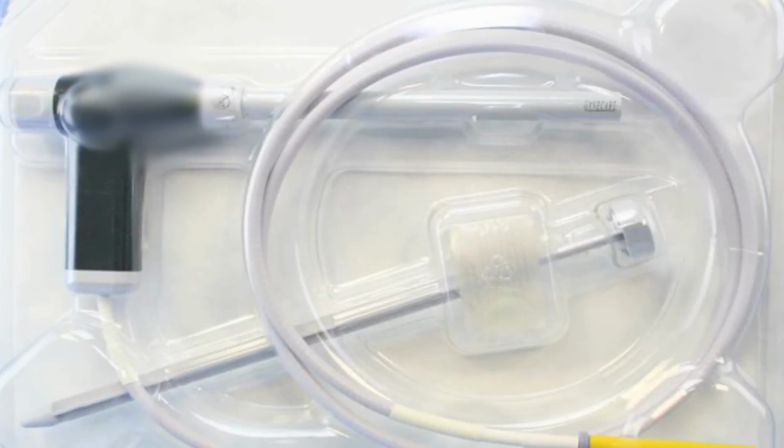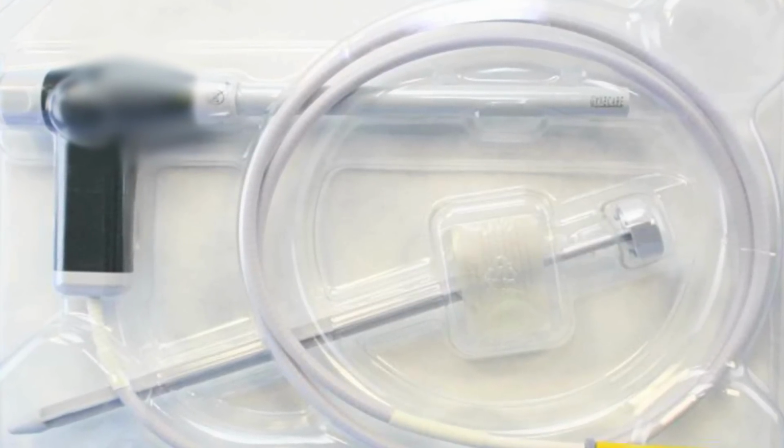The product that we're looking at is manufactured by a number of different manufacturers. Essentially, it is a tool used laparoscopically to remove the woman's uterus by clamping onto it and pulling it to the device, and then the device actually is kind of like a blender or a garbage disposal. As it is pulled into the device, it basically chops up the tissue and then sucks it out of the woman's body. The doctor is able to do this by looking through another incision through a camera to see where that device is, and it actually works very well.